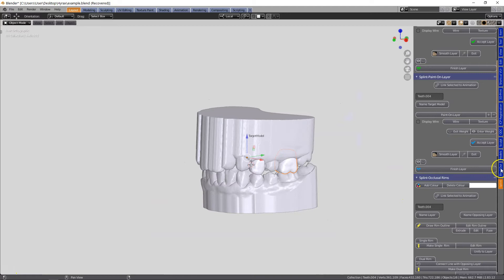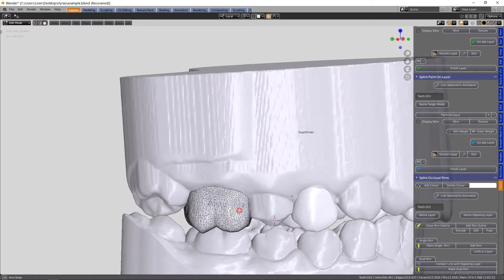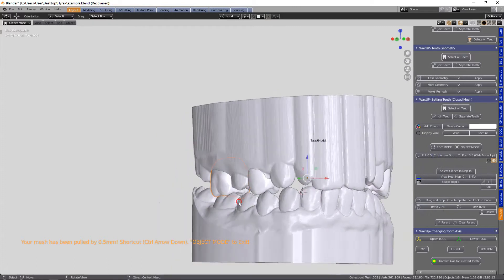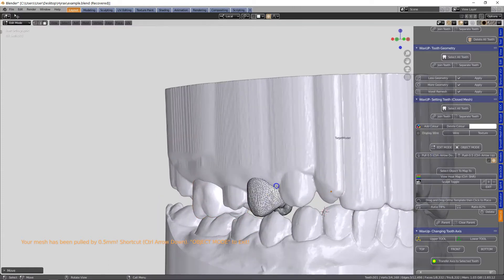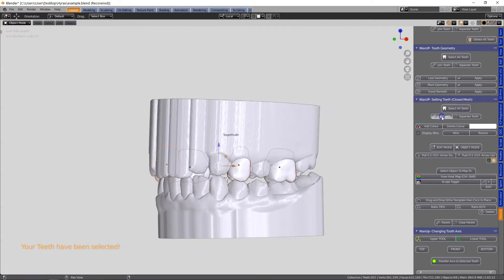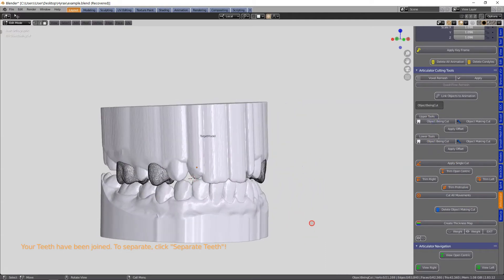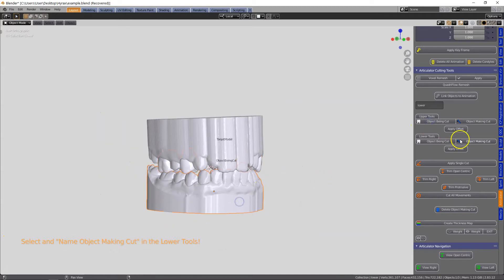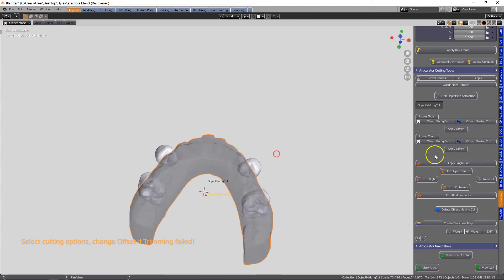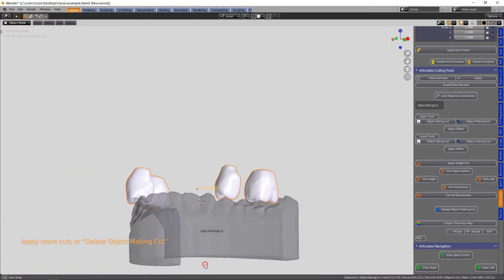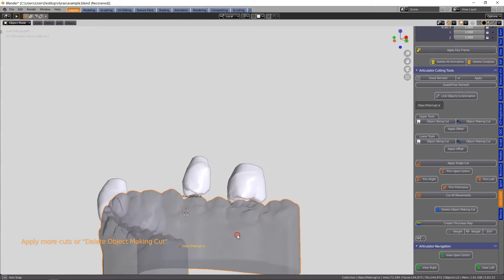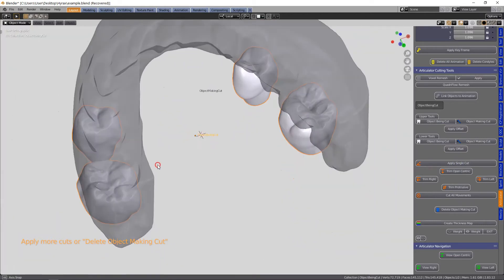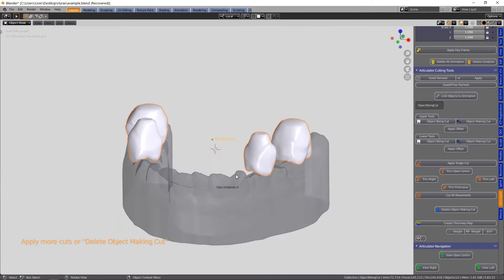In the articulator module we're going to cut the occlusion, so again I'm just being a bit vigilant with the thickness of these crowns. That becomes the object being cut and the lower model is the object making the cut. Don't forget the offset, apply the offset and then we're going to give it one cut. You can do all of the cuts if you want to but we're going to leave this.